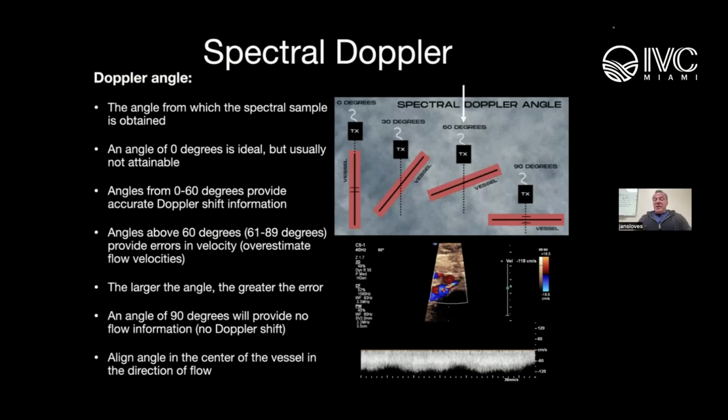Right. So why is that 40 hertz? Well, you can also appreciate that, yes, this is a curved transducer, but you could see that the field of view is very small. If that field of view was opened up really big, those frame rates would be a lot lower. So when I think about constructing an image and interrogating a vein such as this, I'm not really interested in anything else that's going on but that area. So for me, I want the fastest frame rates.